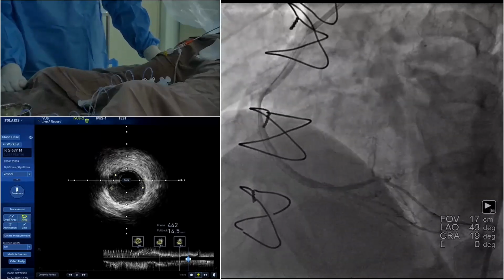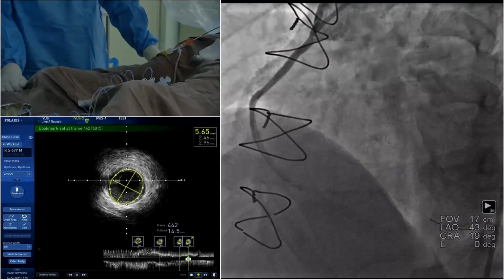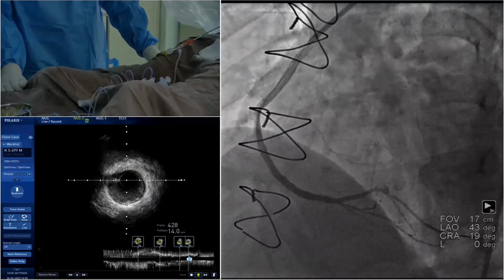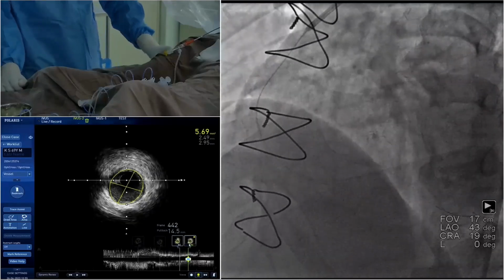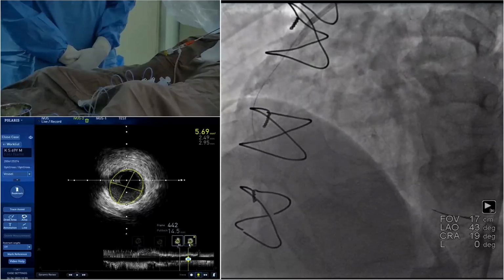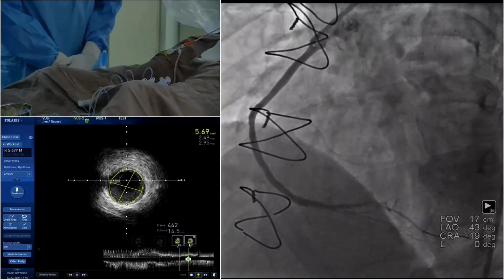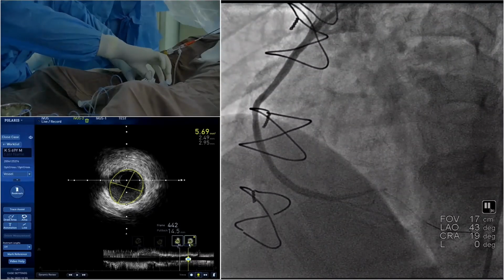So it's nice. What do you think, Ashish? Very nice, I think so. So the distal vessel itself is about the same, and our stent expansion is also about 100% beyond the stent, I'm saying. I don't think there's any chance the small distal tip will collapse. There's a good expansion, nice, well expanded. Proximal is also expanded well with the 3.5 balloons. So we have normal to normal segment expanded stents. Okay, I think he should do well. So let's just give some nitro, take the last shot.